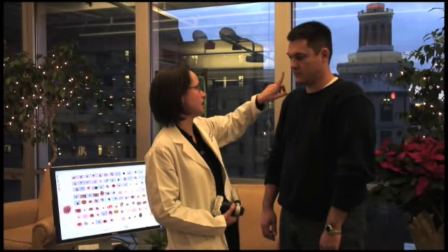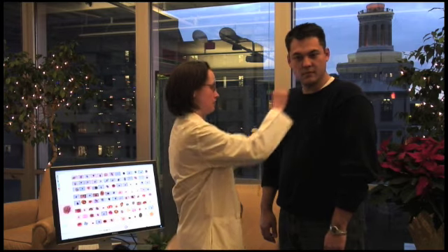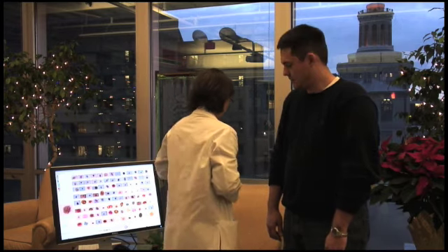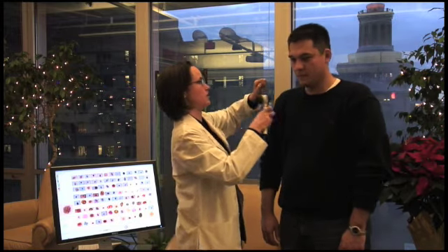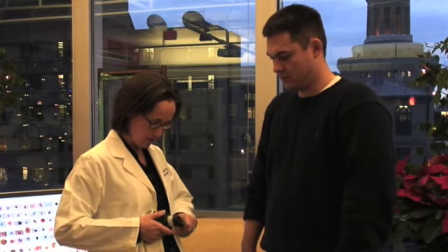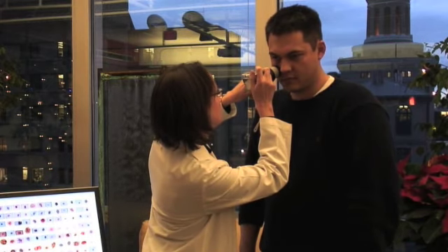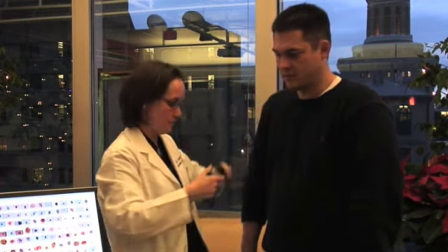So if this is a patient who's in the office for evaluation of, let's say, this mole right here, the way that we would use dermoscopy is to clean the skin with a little alcohol, and I can use my eyes just to examine the mole. If we then want to compare this mole to others in the system, we can take a photograph of it, and then we have a photograph of that dermatoscopic image, and we can download it into the system.